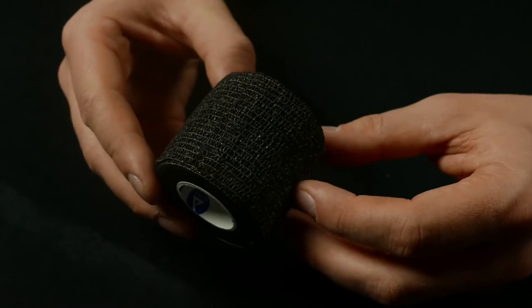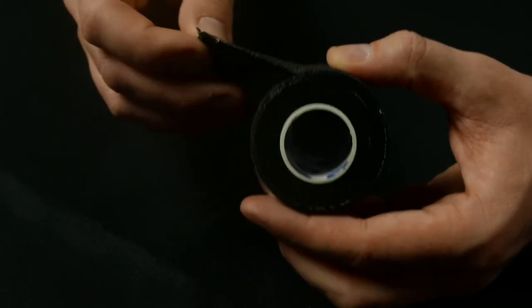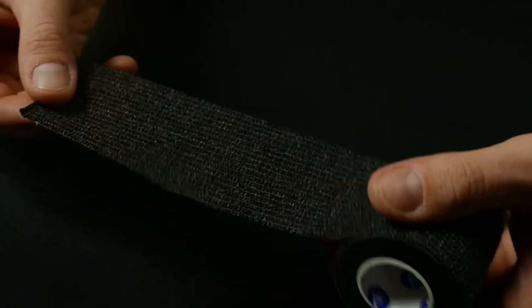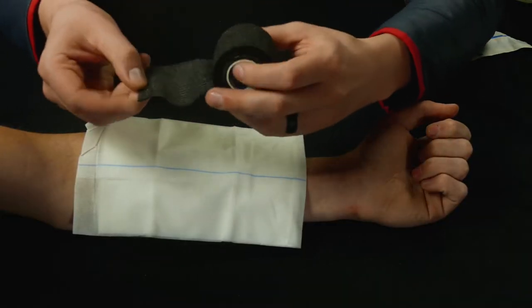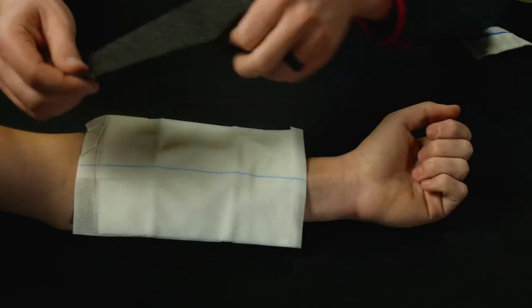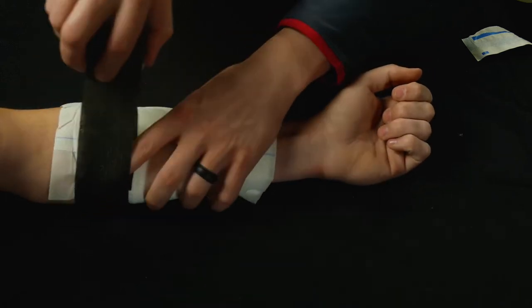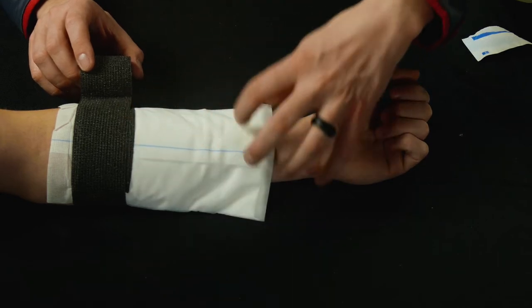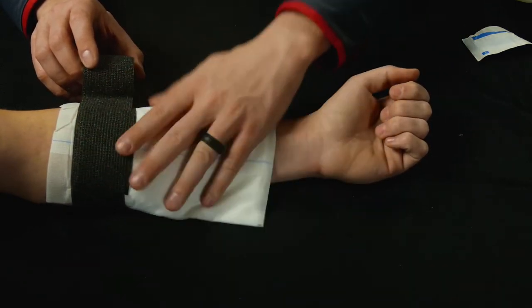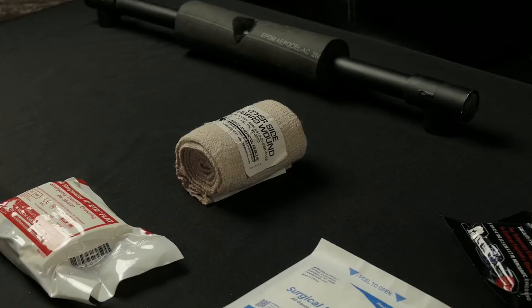Something else you can use is co-ban. Once the dressing is in place, you can bandage it with co-ban. This co-ban is stretchy and sticks to itself — from Dynarex, it's actually called Sensi-Wrap, though some people call it co-ban. It's a self-adhesive bandage, so you wrap it around to hold the dressing in place. Because it's stretchy, you do have to be careful not to put too much pressure and start occluding circulation back to the arm.